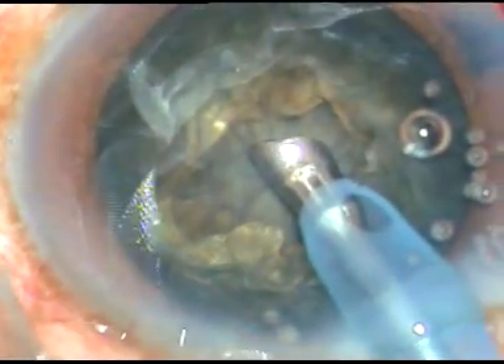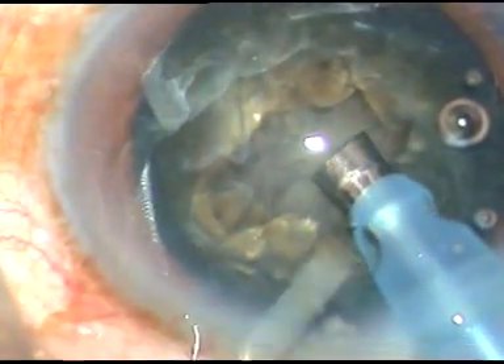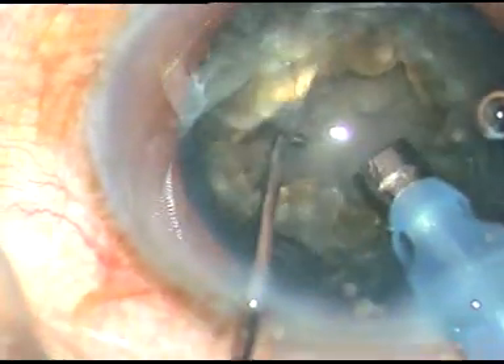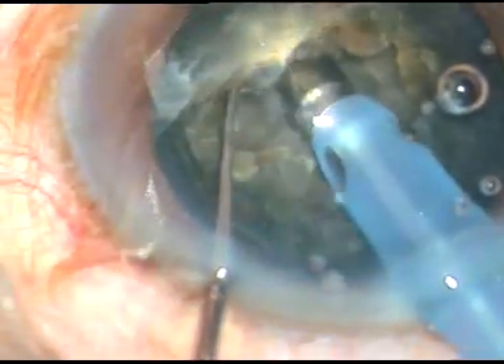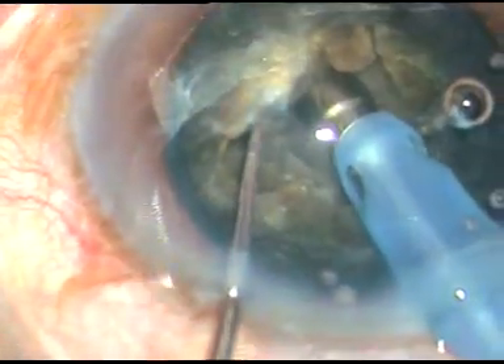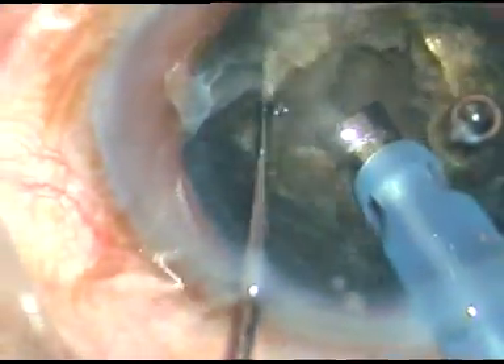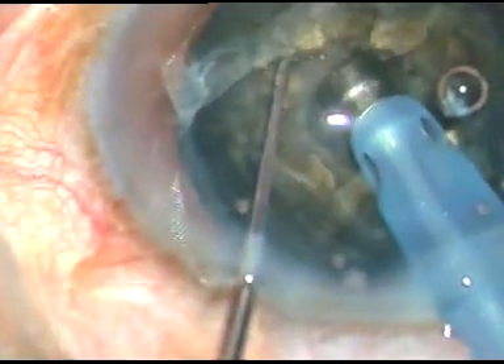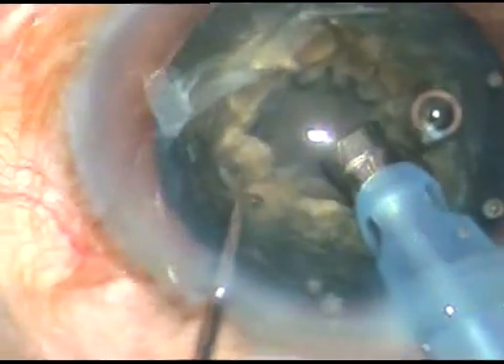Now after sculpting for some time, I make the bevel up and again I do some more sculpting. The central core of the nucleus is removed and the nucleus is weakened.